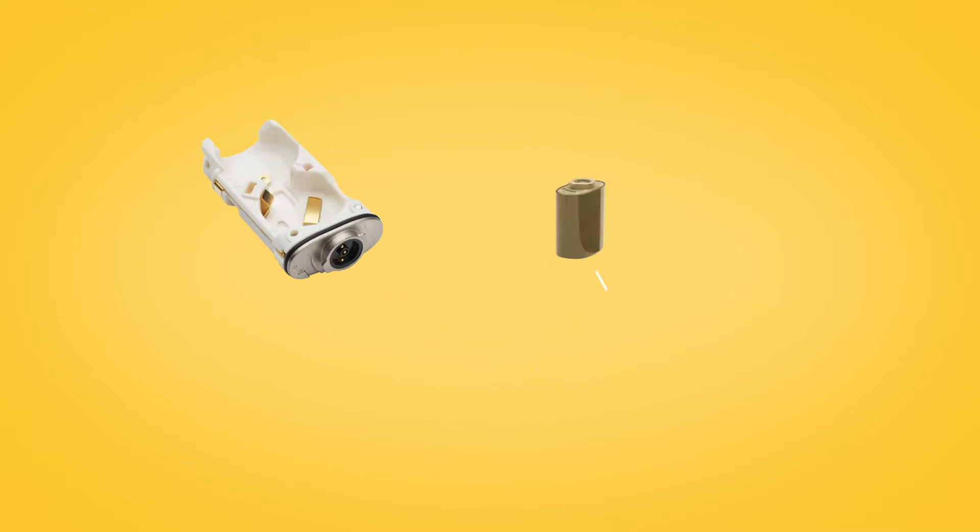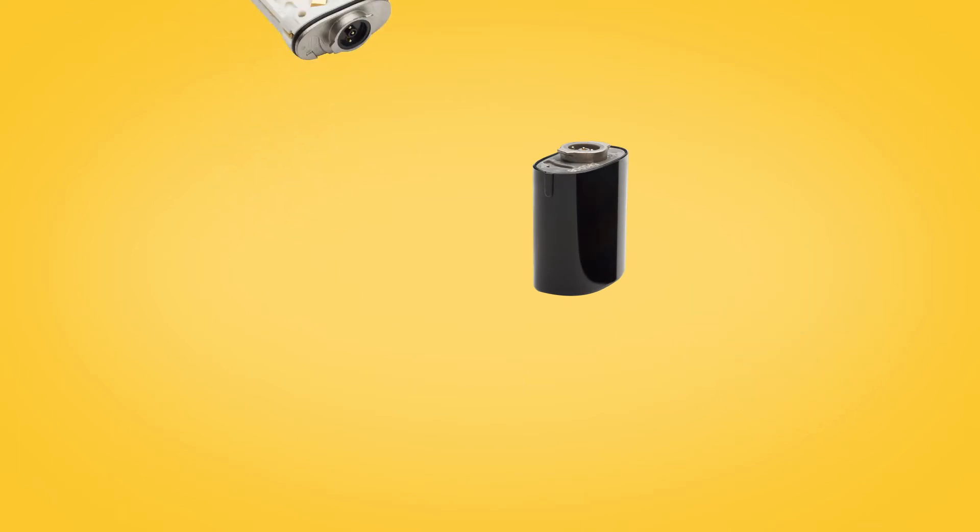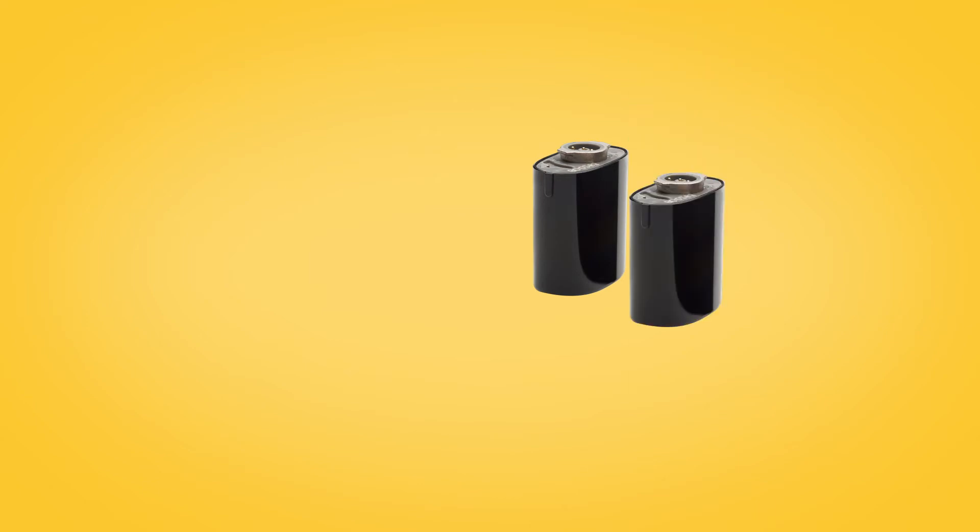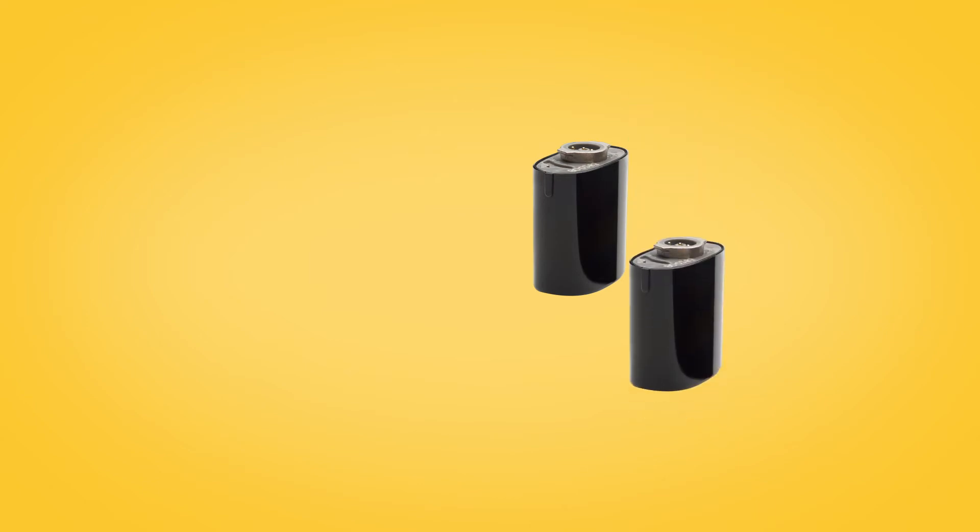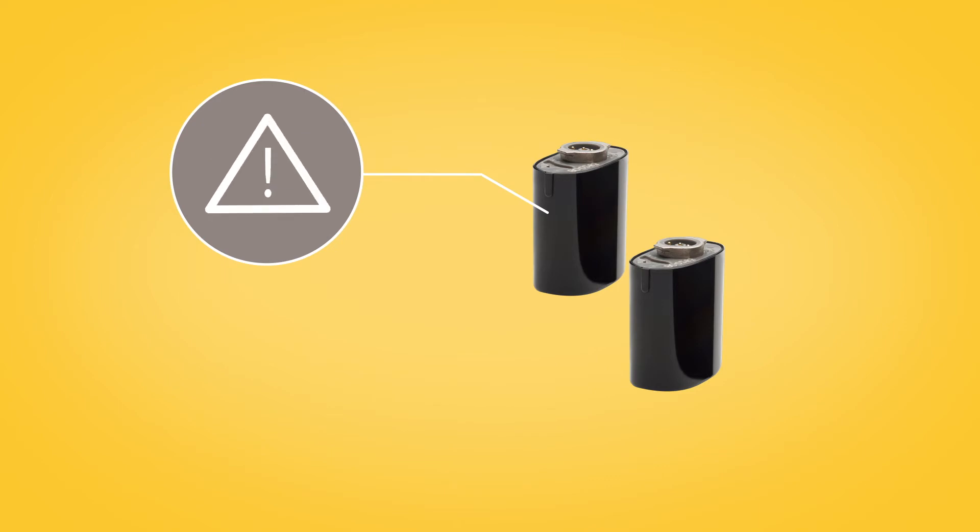If you are using a rechargeable battery module, remove it and store fully charged. When storing more than one rechargeable battery, be sure the connectors do not touch, as this could short the batteries.